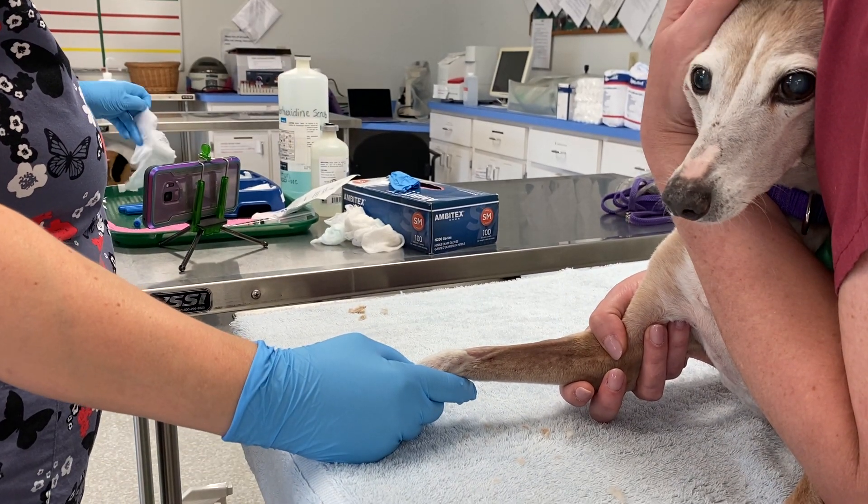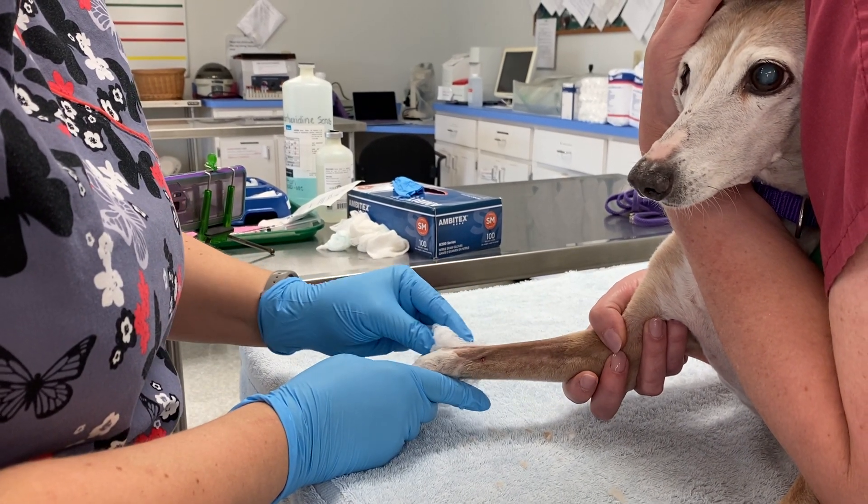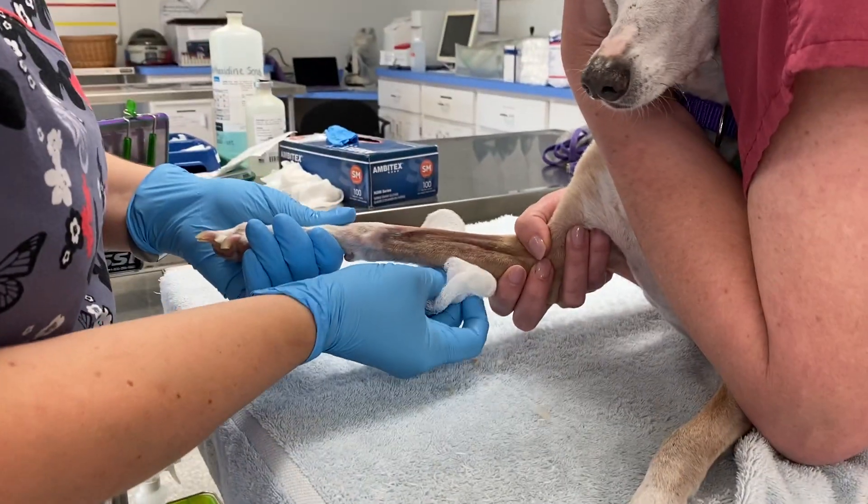Once you have the scrub, you're going to need to dry the leg using dry gauze. You don't want to dry it over the spot that you're placing the catheter — you want to dry the sides and underneath.